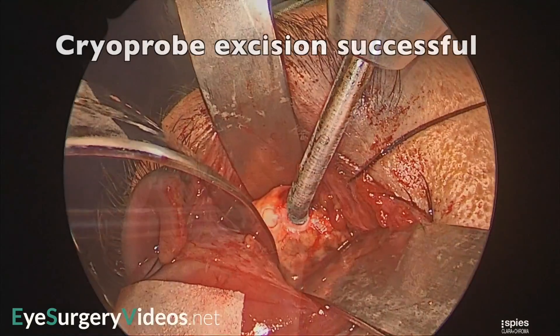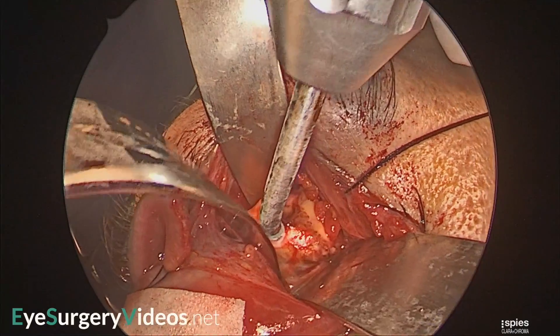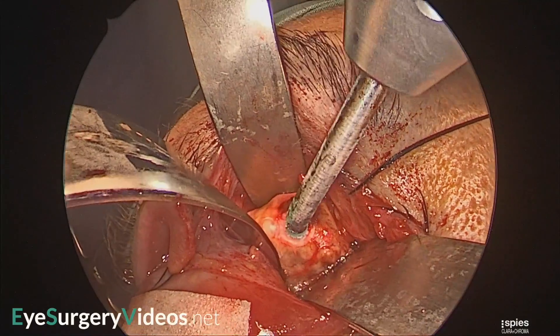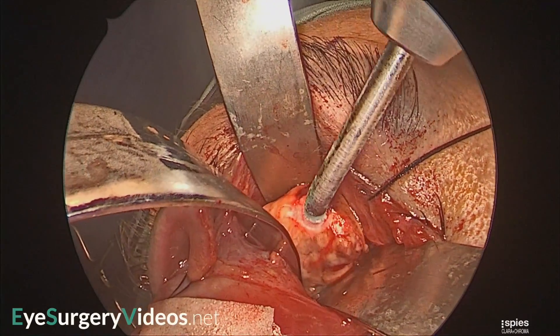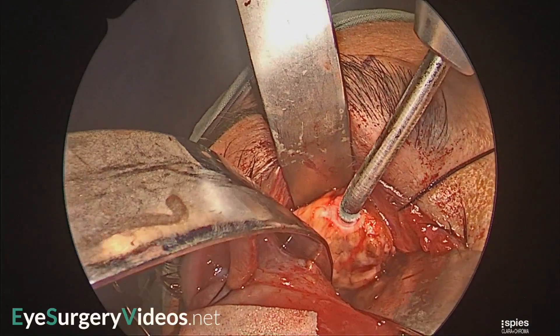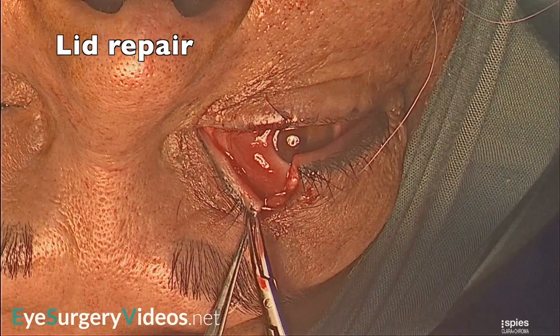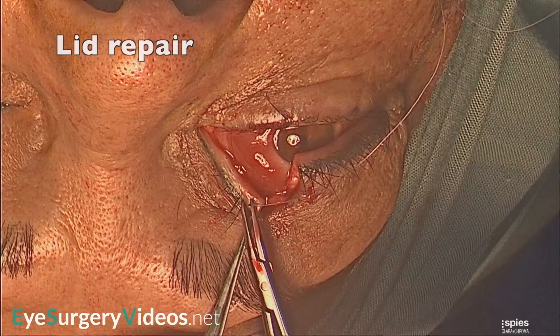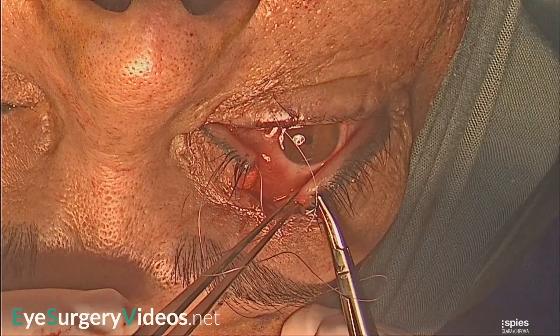The cryoprobe is then applied to the lesion which is gently and continuously raised. The eyelid is then repaired as per any other full thickness lid laceration.